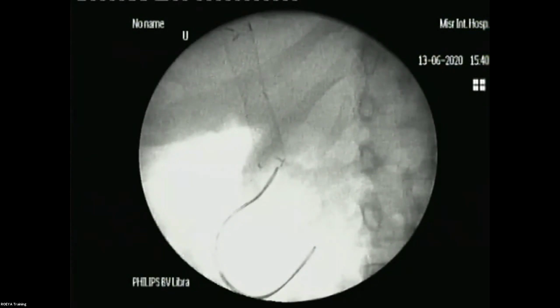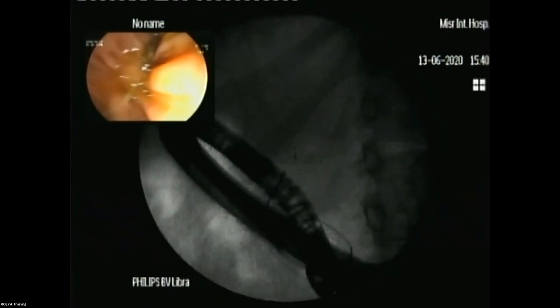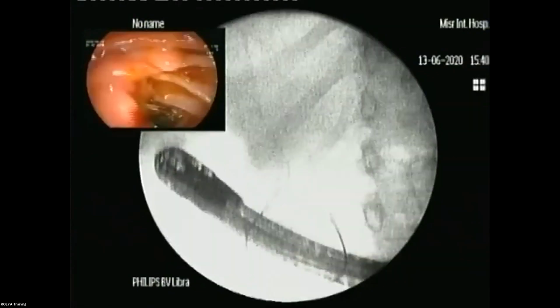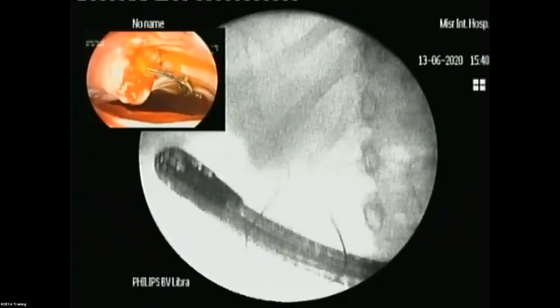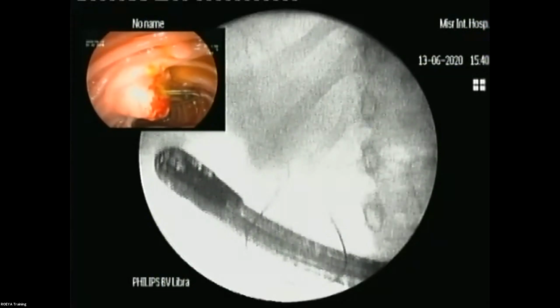Because when it is easier to reach the papilla, you can get out with the stent and the scope together, and then return easily to reach the papilla. This is to keep the scope working perfectly and to avoid any internal leakage inside the scope. Okay. So now, Hani, you will go for the metallic one.